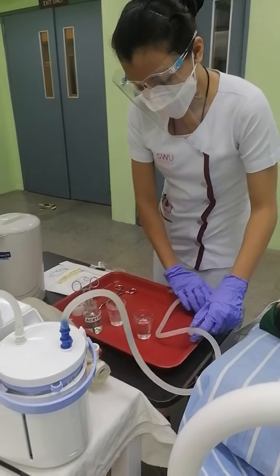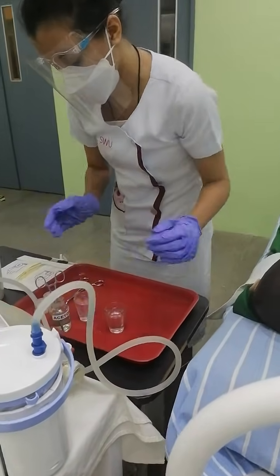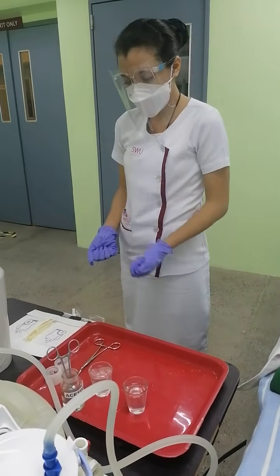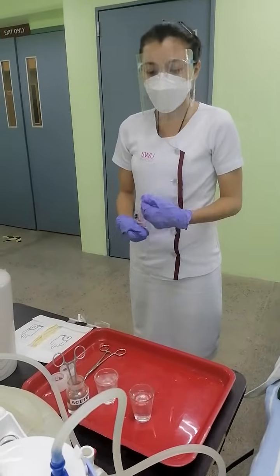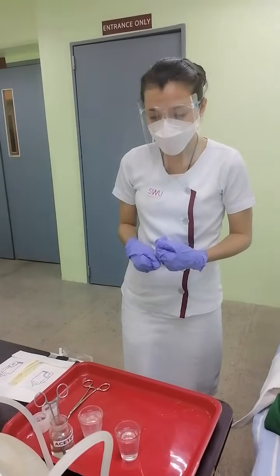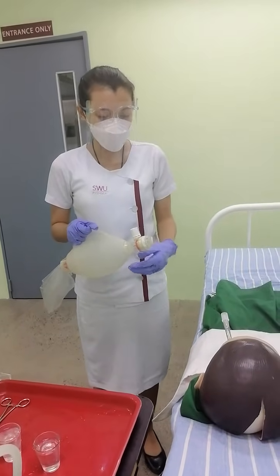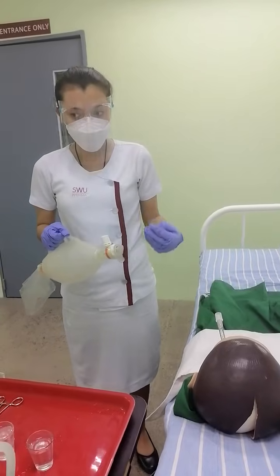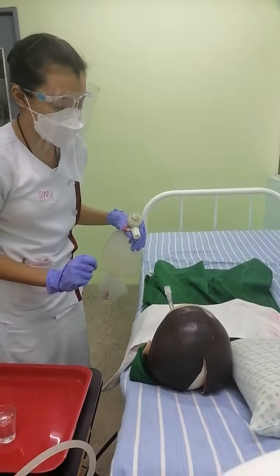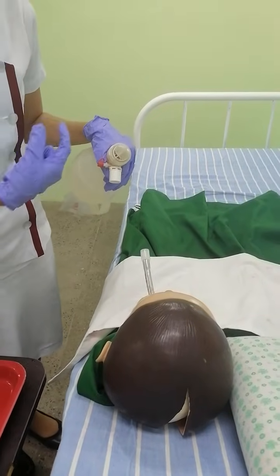I will prepare the sterile catheter tip. Then I will pre-oxygenate the patient with 100% oxygen using the manual resuscitation bag. The purpose of this is to provide oxygen to the patient and to prevent the patient from entering a hypoxic state before starting the procedure. I will stabilize the tube in order to prevent it from dislocating and also to prevent trauma to the trachea.